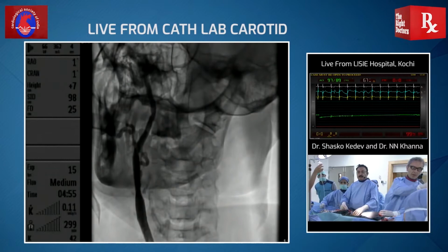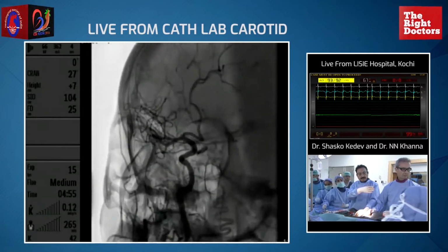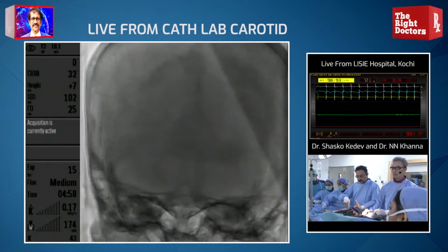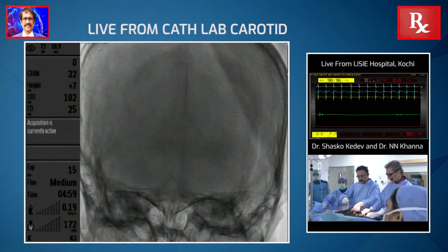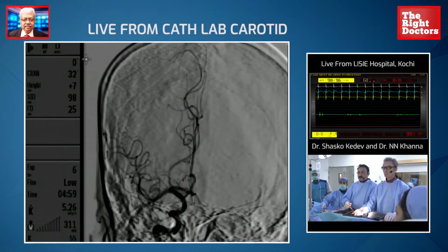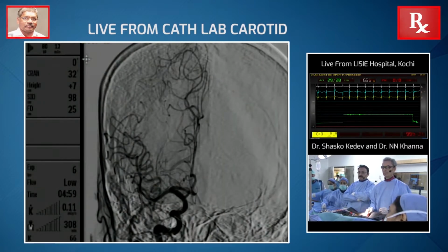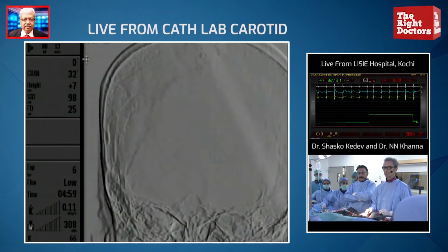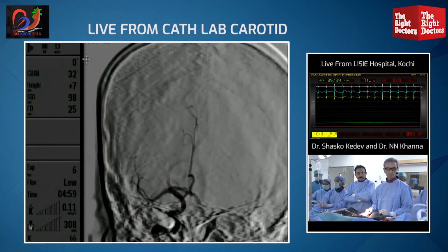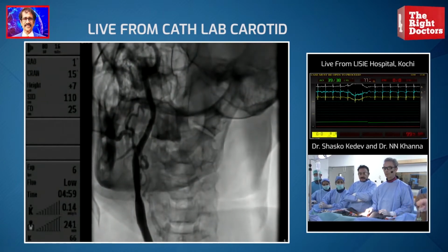Okay, we can make AP cranial just for intracranial QCA, now DSA. Head straight, absolutely straight, and go a little more cranial. Ready? Just 1 second. Okay. So what we see here is we can see both anterior cerebral, middle cerebral. There doesn't seem to be any cutoff. The patient is fine. Can you ask her to lift her left upper limb? Okay. So she's okay.